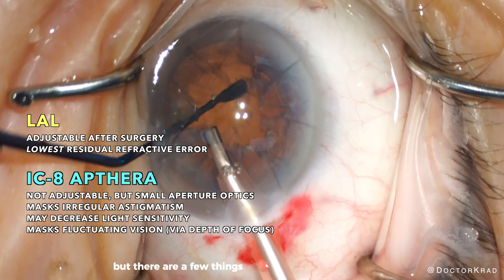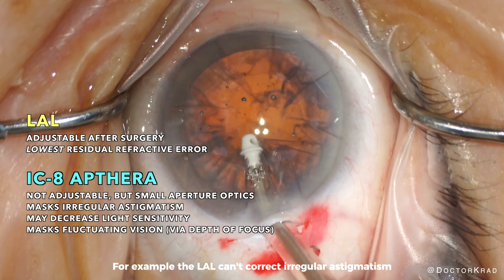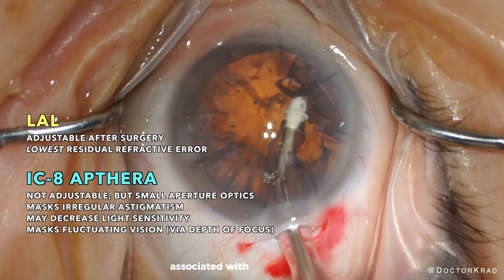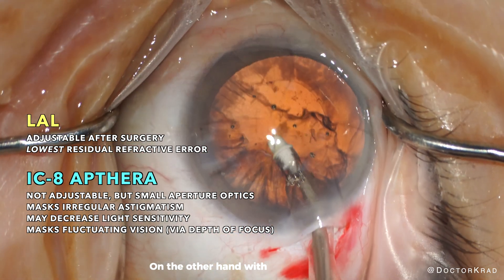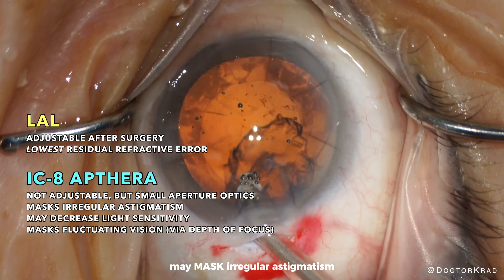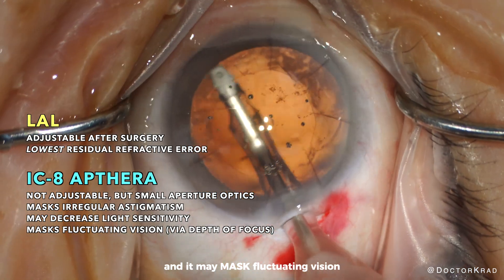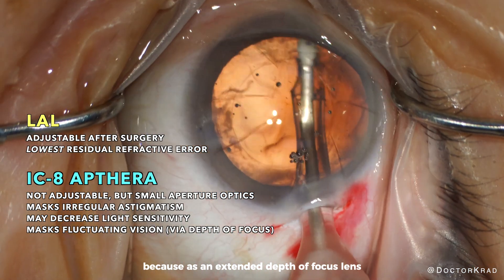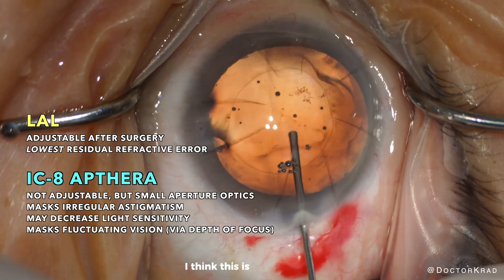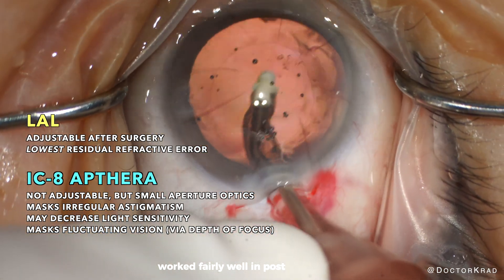But there are a few things that the LAL doesn't address. For example, the LAL can't correct irregular astigmatism, and it doesn't reduce light sensitivity and fluctuating refractive error associated with the RK incisions. On the other hand, with the IC8 Apthera, the small aperture feature may mask irregular astigmatism, it may decrease light sensitivity, and it may mask fluctuating vision because as an extended depth of focus lens, the vision may remain clear over a broader range of dioptric power. This is why previous extended depth of focus lenses, such as the Symphony, worked fairly well in post-RK patients.